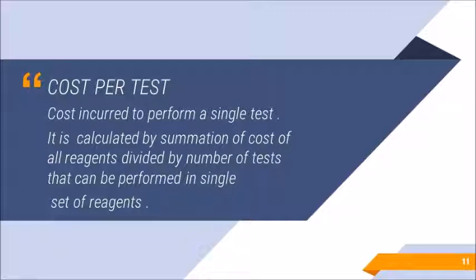When you compare a single cartridge system and a multi-cartridge system, in the single cartridge system, the cost of the single cartridge will be the cost per test. When it comes to a multi-cartridge system, the total cost of the module or the optional or additional calibrant fluid, divided by the number of tests that the entire module can perform, will give you the cost of a single test. So the cost per test is a parameter taken into consideration after the technical superiority is determined.